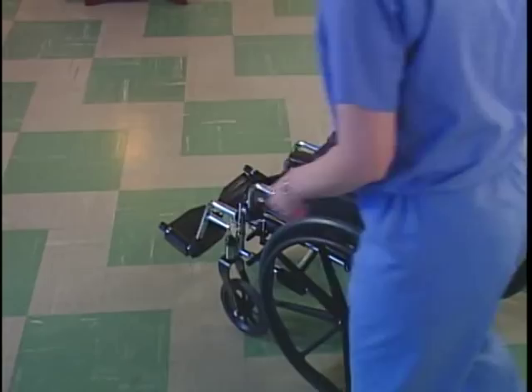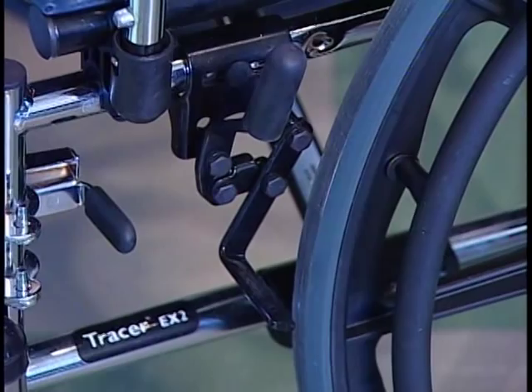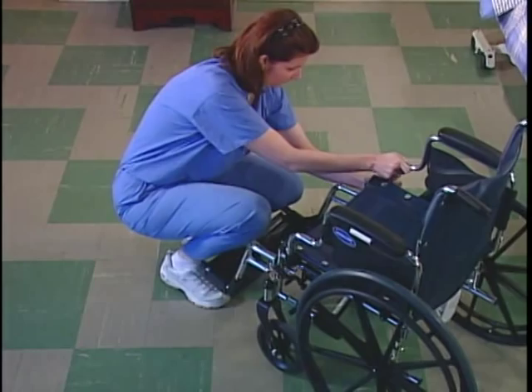Move the wheelchair near the bed. Lock the chair's wheel locks to prevent movement and move the front riggings out of the way.